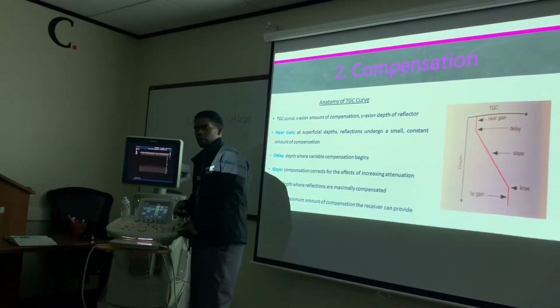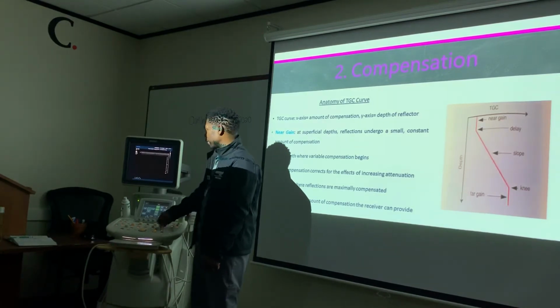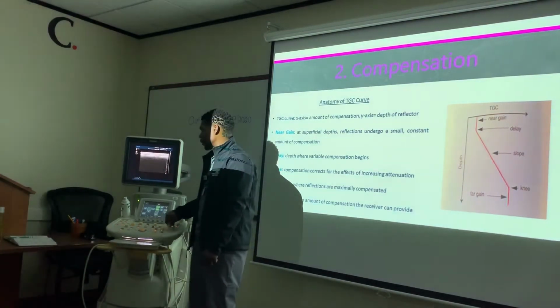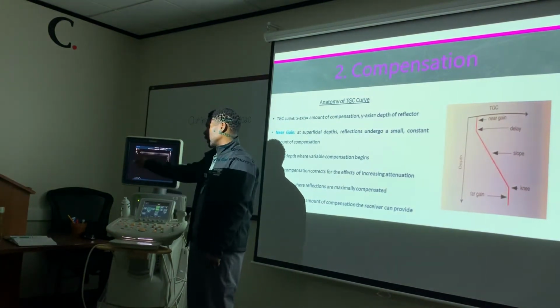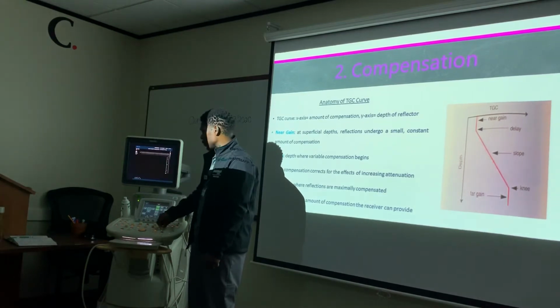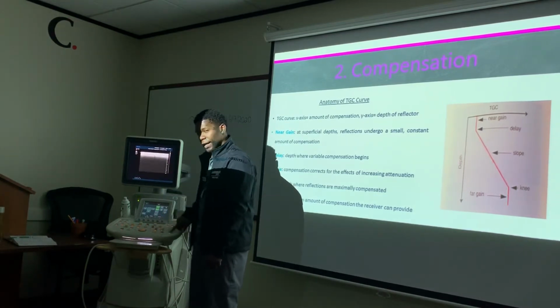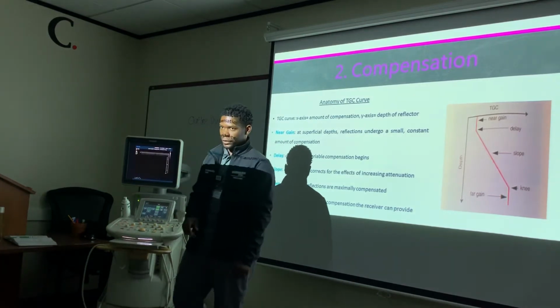So it just stays lit up. It's gonna stay. So I have it dark right now. I can brighten it up to where I want it to be. I can hit it again. And now when you see it automatically change back to 51%. I brought it all the way to 100%. I hit eye scan, it brings it back down. Now it's at 49%. Okay.